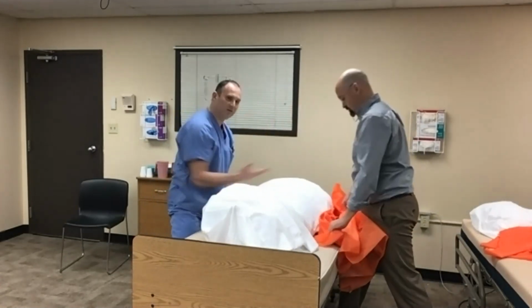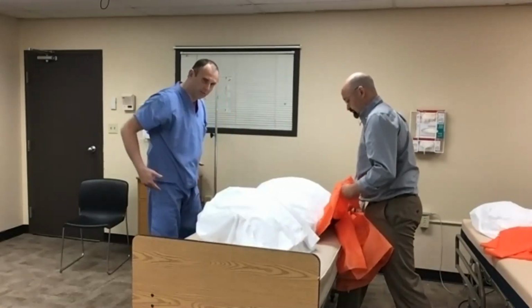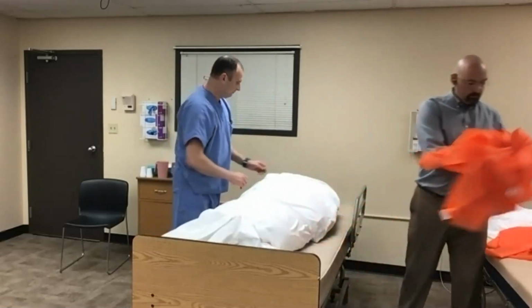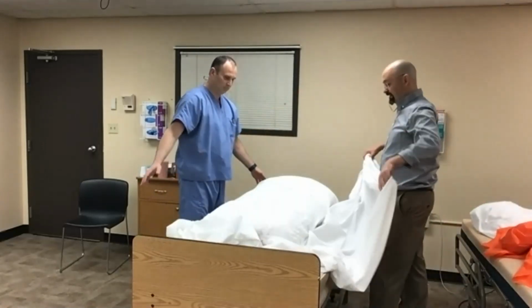And again, that last little push underneath, it's just a quick push using the slide sheet, and then I'm able to get my hands out of the way. And now we got George back where he needs to be. We can leave this here.